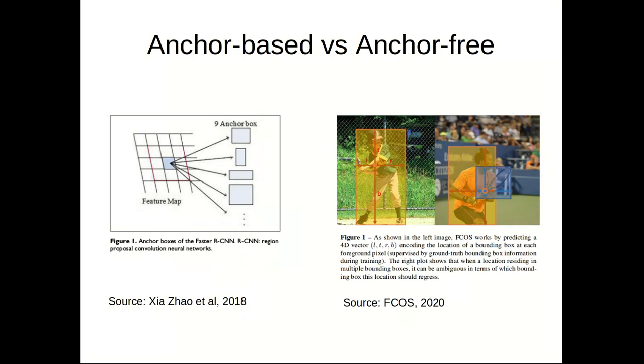The main contribution of predefined anchors comes from the fact that they explicitly bring the requirement for multi-scale and multi-shape differentiation abilities to the core of the training process, and they do that by incorporating this requirement into the very basic structure of the loss manifold. The second advantage of anchor-based methods is that they allow achieving multi-scale abilities even when using a model that can look at the input only at one fixed scale, or in other words, has only one fixed receptive field. Predefined anchors also make it easier for the model to regress the bounding box around the opacity correctly from a pure technical computing power perspective.